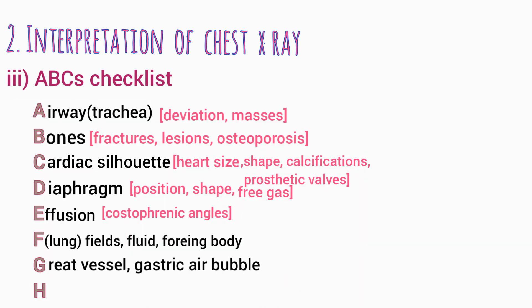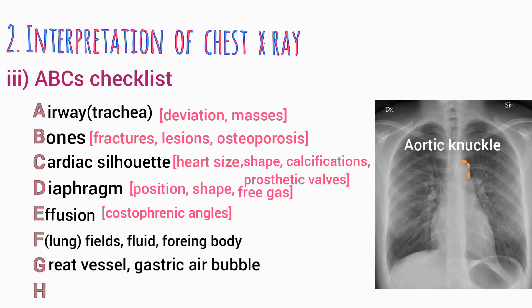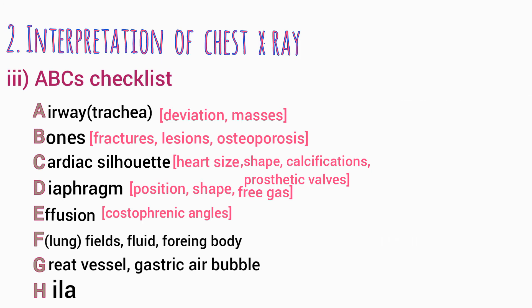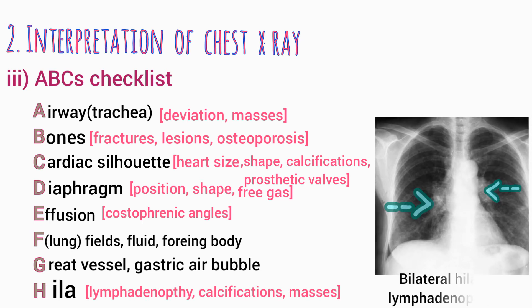G is for great vessels and gastric air bubble — check the aortic size and shape; the aortic knuckle should be clearly seen, and gastric air bubble should also be visible. H is for hila — evaluate each hilum for lymphadenopathy, calcifications, and masses.